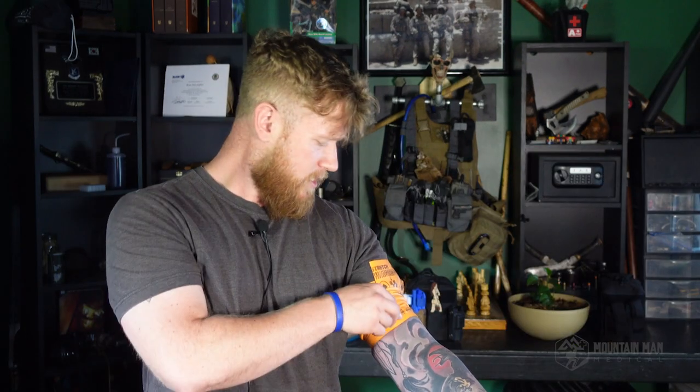Make sure you're pulling it nice and tight. Give yourself a little room on that last turn so you can slide it underneath — now you've got it stretched, wrapped, and tucked. You definitely want to practice this. You don't want to be trying to learn it when you need it most.